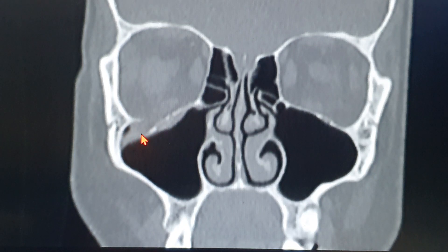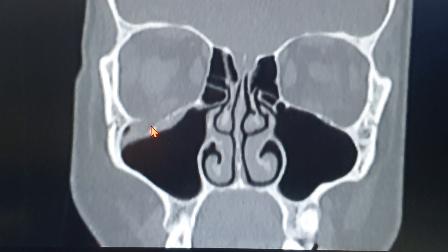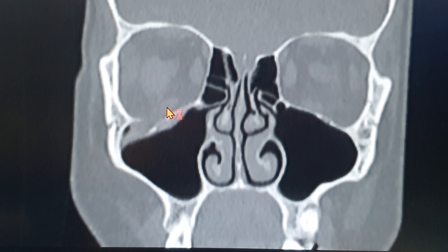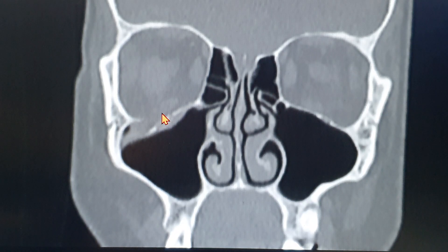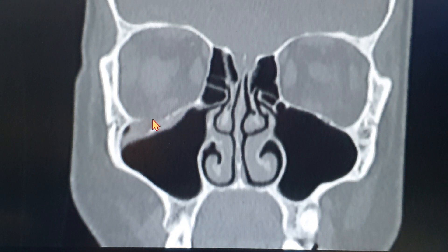You can see a lot of soft tissue opacification, but in this case the inferior rectus muscle is not getting pulled up into the maxillary sinus or towards the fracture side — hence the patient did not have any diplopia on movements. The patient could also easily look down without any lagging of movements. The second important point is the patient's complaint of numbness and altered sensations on the right nasolabial fold area and the upper lip — basically the medial part of the cheek. You have to keep in mind the course and route of the infraorbital nerve.